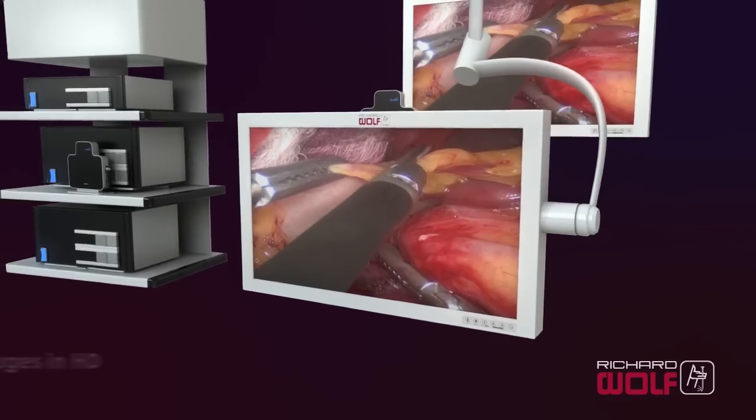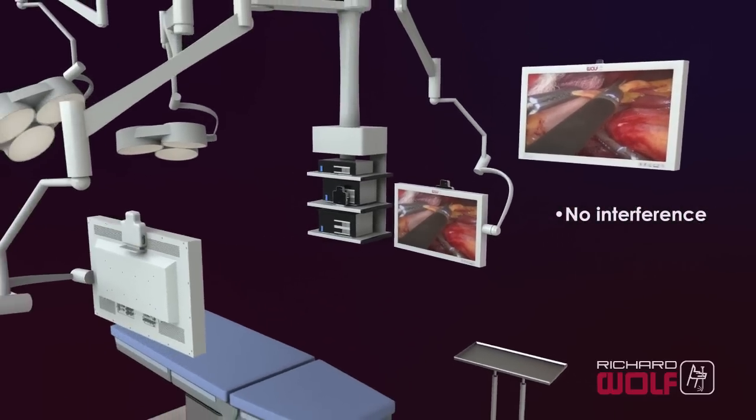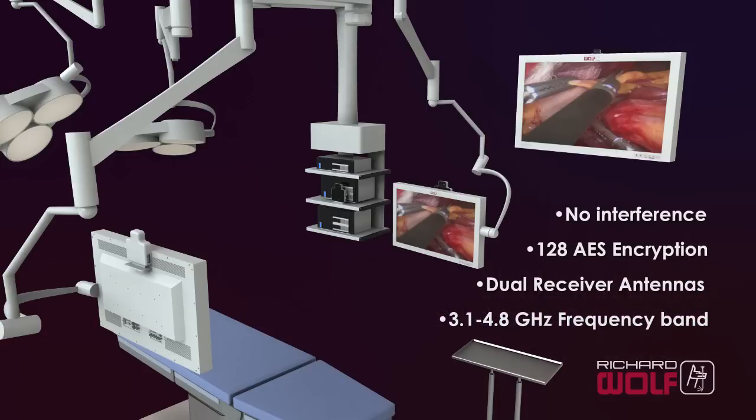ZeroWire also provides reliable communication required for today's multimodality imaging environments. This includes no interference to other equipment in the OR, 128 AES encryption for patient data protection, dual receiver antennas for redundancy, and operation in the 3.1 to 4.8 GHz frequency band that is protected against interference from wireless LAN, cordless phones, cell phones, and other wireless devices used in the office environment.